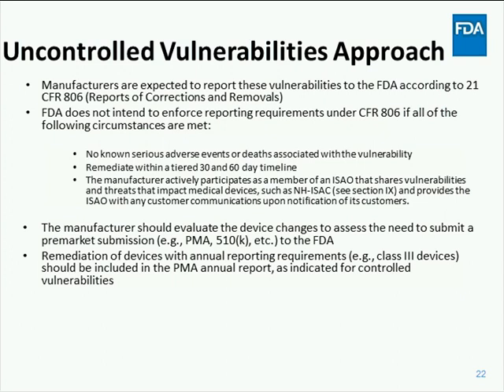With regards to the customer communication, it should, at minimum, describe the vulnerability, including an impact assessment based on the manufacturer's current understanding, and state that manufacturers' efforts are underway to address the risk of patient harm as expeditiously as possible. Describe compensating controls, if any, and state that the manufacturer is working to fix the vulnerability, provide a defense-in-depth strategy to reduce the probability of exploit and/or severity of harm, and will communicate regarding the availability of a fix in the future. FDA recognizes that not all vulnerabilities will be able to be completely remediated within the 60-day total time frame. FDA hopes that the policy serves to initialize and optimize manufacturers' patch management programs such that the 60-day total time frame can be met.